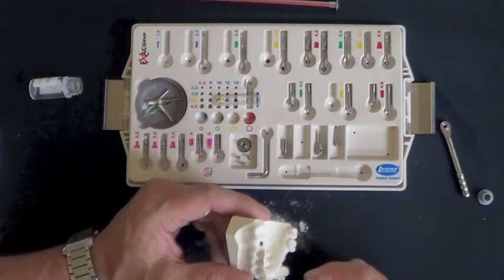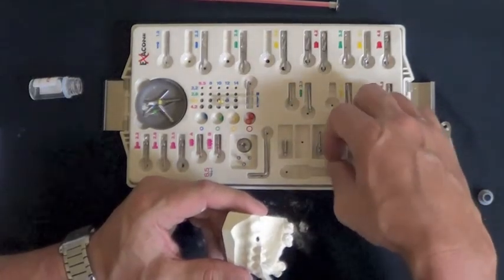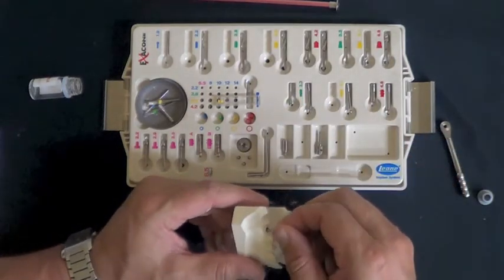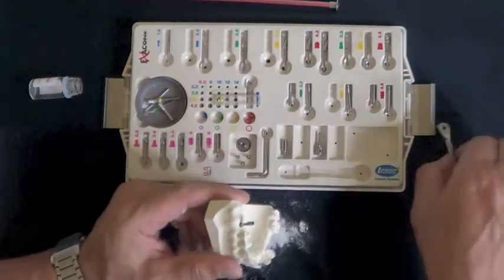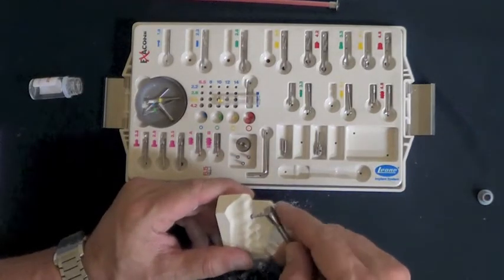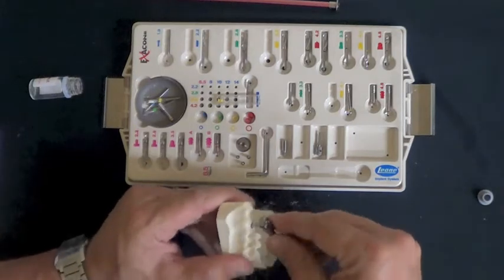If you desire to drive it into the osteotomy further, you could certainly attach the hex driver into the implant. Grab your ratchet and potentially turn this implant in even further with the driver.